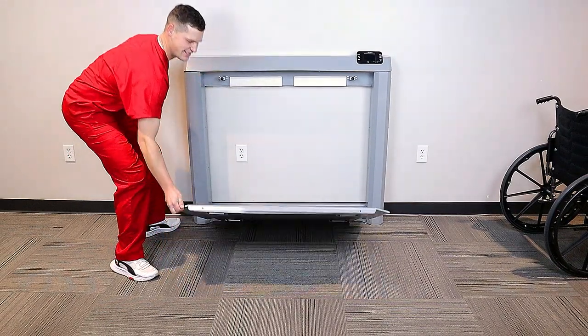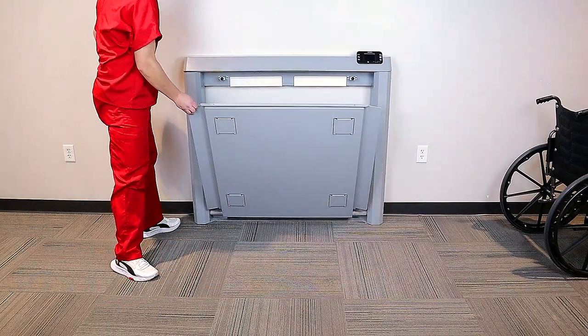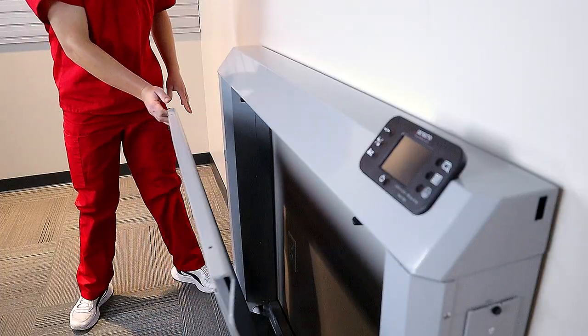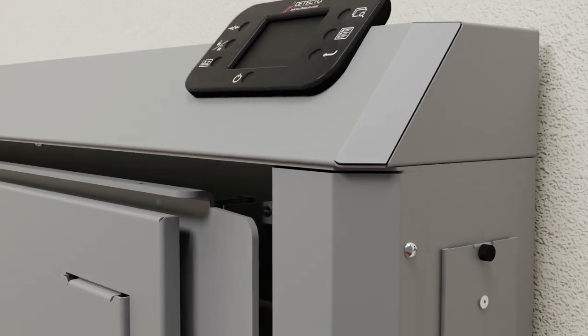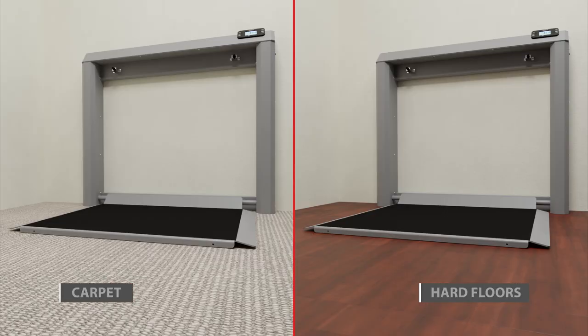After you're finished weighing, simply raise the platform and the gas spring lifting mechanism will take over and return the platform to its vertical compact position snug against the wall. No heavy lifting is required, and the scale may be used on carpet or hard floor surfaces.